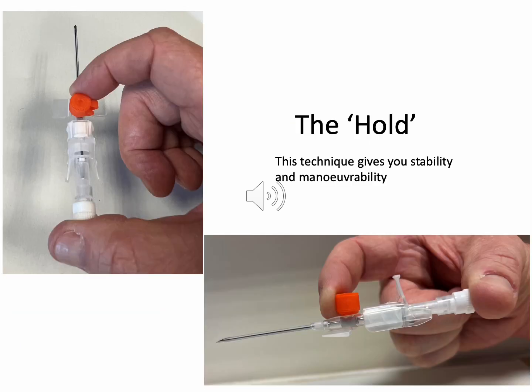Now, the way to hold the cannula. The technique demonstrated in this slide gives both stability and maneuverability, while most importantly allowing you to have clear sight of the hub into which you expect to get the flashback of blood. Note also that the middle finger down to the little finger are curled away from the cannula, allowing you maneuverability and freedom.